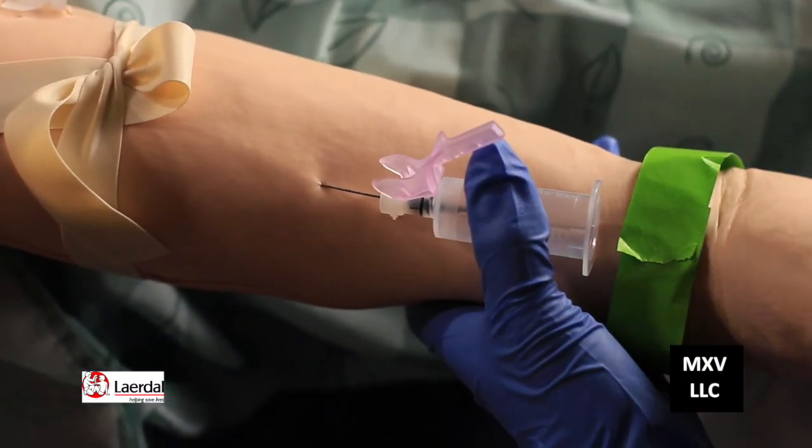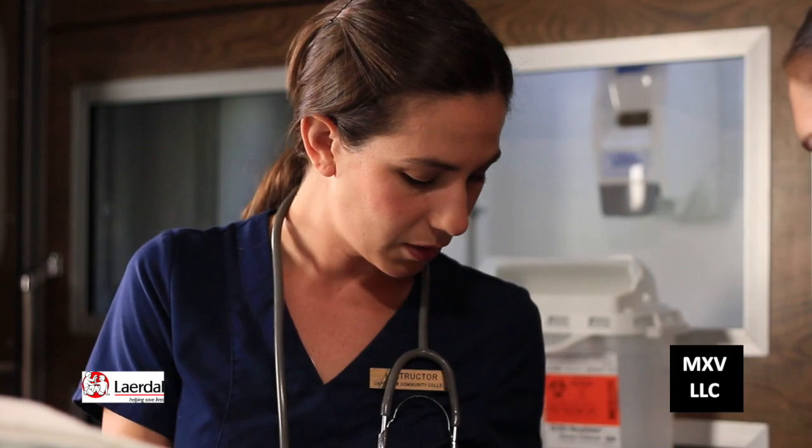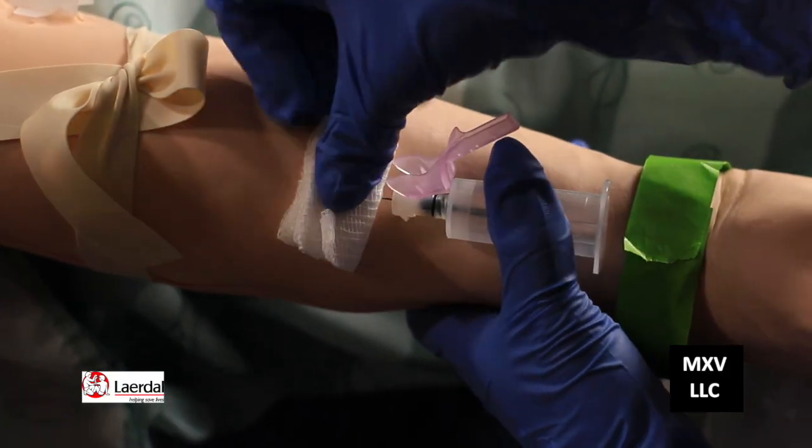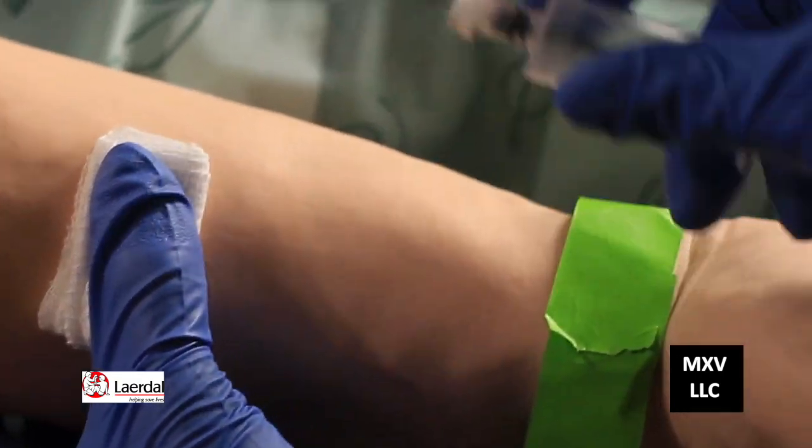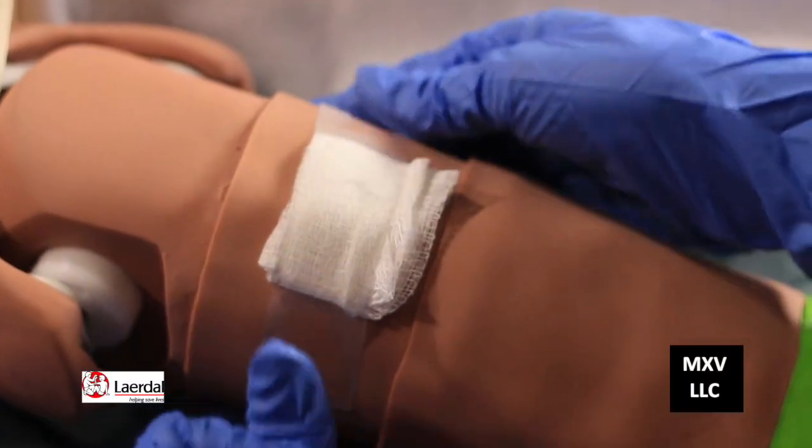See? It's filling up. Wait until it stops. Shake it once or twice. Get your gauze. Pull the tourniquet, take out the needle, and secure it. Grab your tape, and you want to make sure you put the needle in the sharps container.